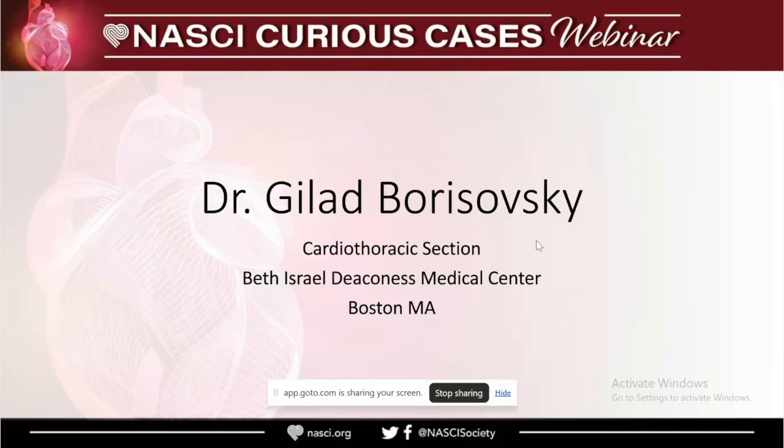Okay, so I will introduce myself. I'm a cardiothoracic radiologist from Boston, Massachusetts, and I have accumulated a sample of a few interesting cases. I'm going to try and introduce you to those cases. We'll start with the warm-up case, and then we'll progress to other cases.